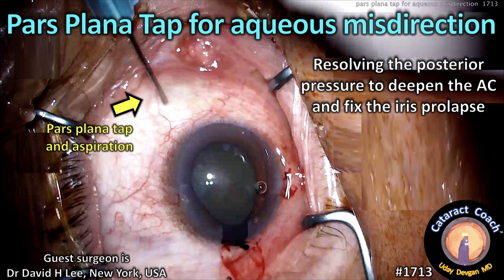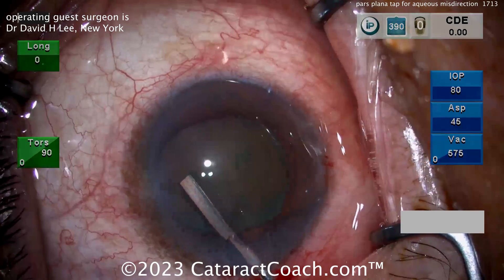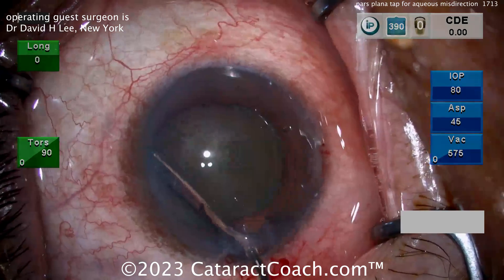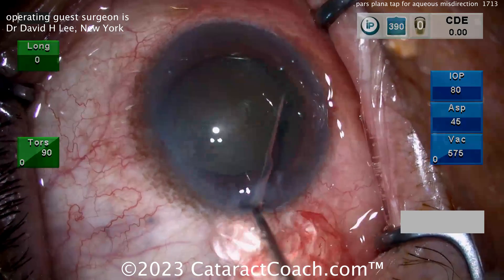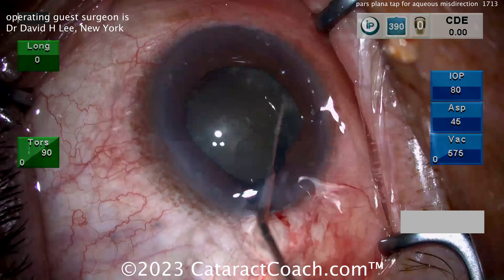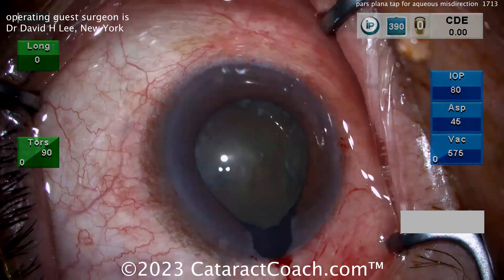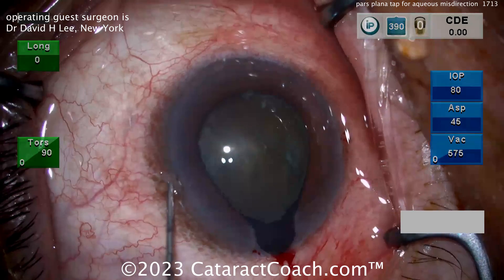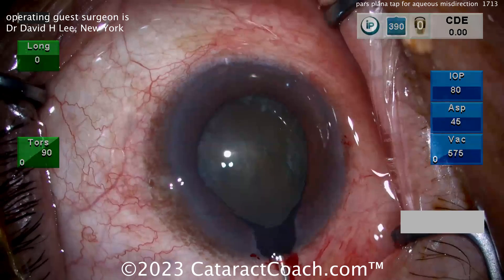cataractcoach.com: pars plana tap for aqueous misdirection, resolving the posterior pressure to deepen the AC and fix that iris prolapse. Watch carefully — hydrodissection is done. Here comes a big cannula and the fluid wave goes across. Look at the incision — look how much viscoelastic escapes. All that viscoelastic that came out of the eye has been replaced by BSS, causing iris prolapse. The AC is shallow, pressure of the eye is sky high, the eye is firm. Now what do you do?